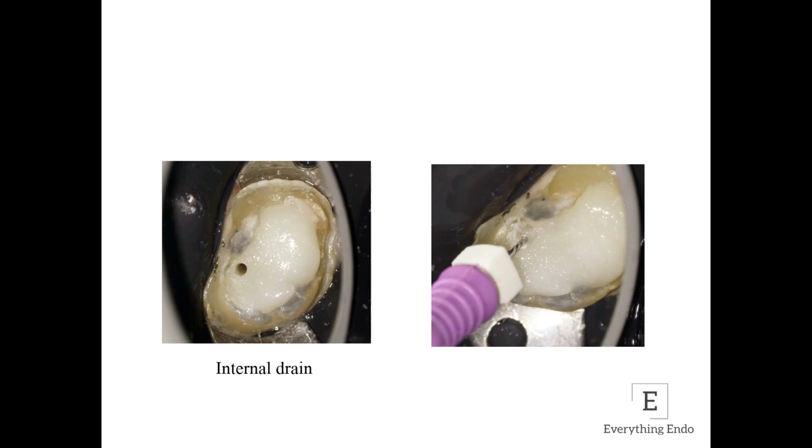And after the discharge completely stopped, we gave the patient a calcium hydroxide dressing. And as of now, we have kept him under observation. And once there is some evidence of the lesion healing, we would probably consider an obturation.